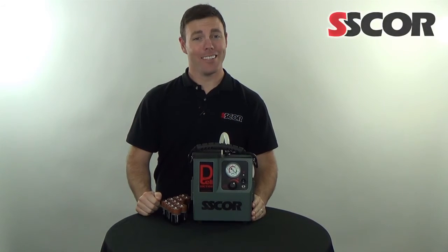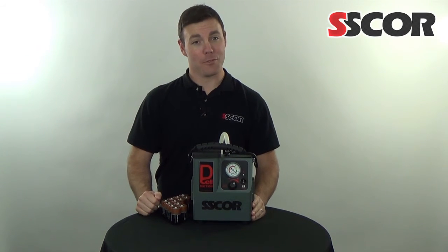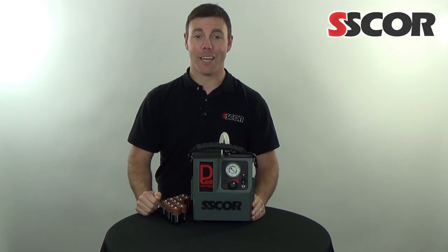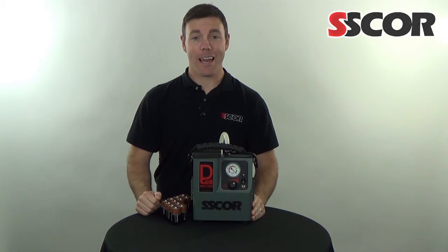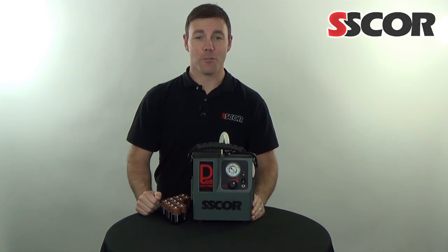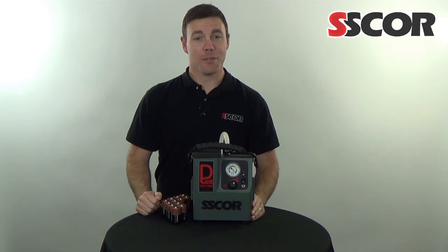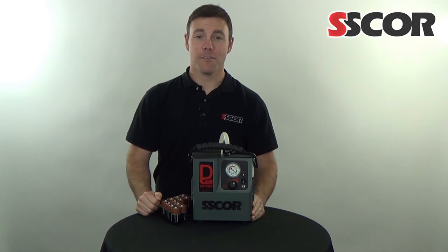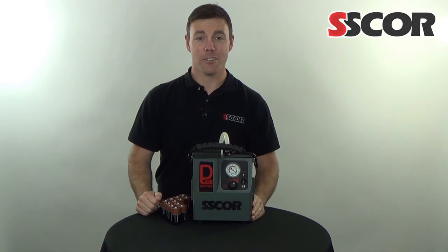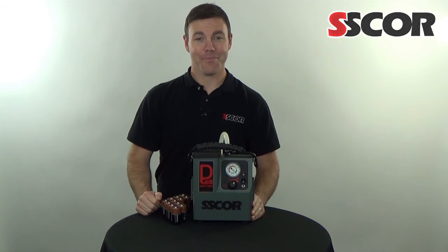In regards to sanitation and disinfection, it is best practice to, as soon as possible, dispose of the single-use disposable canister, patient tubing, and catheter according to local, regional, and national requirements for the disposal of hazardous waste materials. The DCell suction can be cleaned using a mild detergent and, if necessary, disinfect with a mild disinfectant such as 10:1 bleach and rinse using clear water to remove any residue.